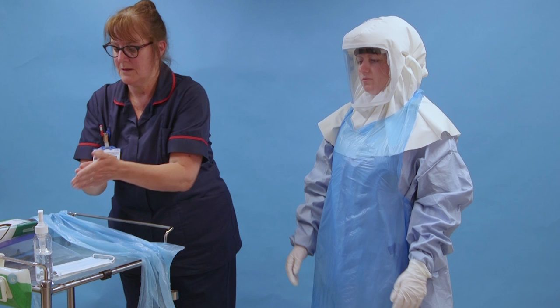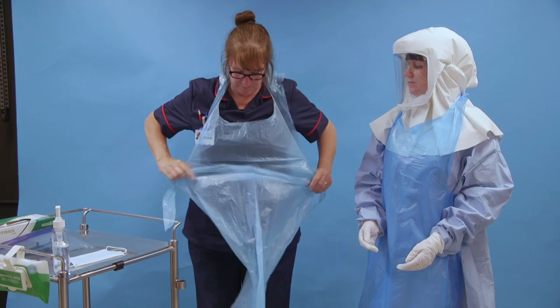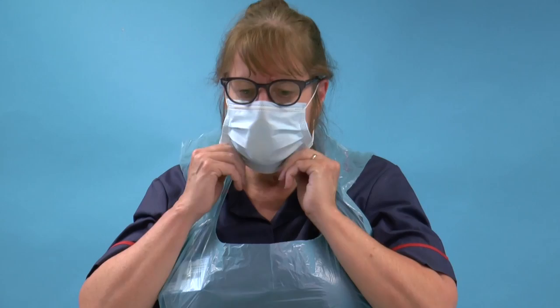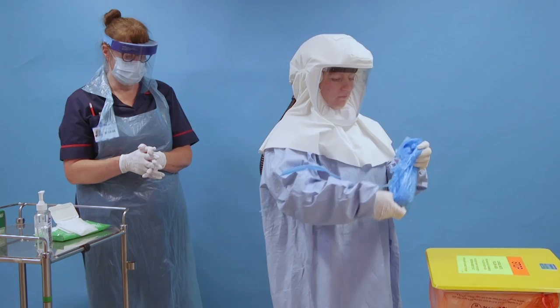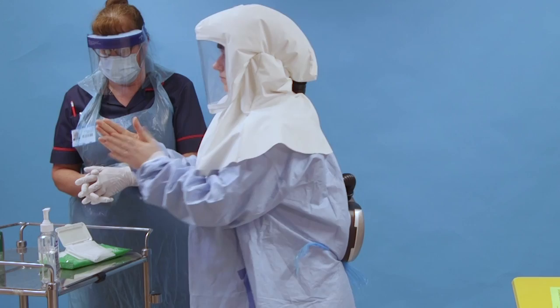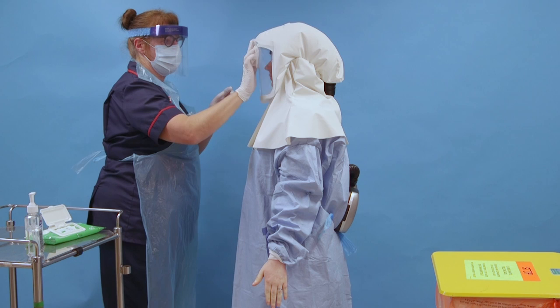Doffing your Perso respirator and other PPE is a two-person procedure and must be done with a buddy. The buddy cleans their hands using alcohol hand rub and puts on PPE: an apron, a surgical mask, eye protection if required, and gloves. Remove your gloves and apron if worn and dispose of them as clinical waste. Clean your hands using alcohol hand rub. The buddy then decontaminates the Perso hood using Clunel universal sanitising wipes in the green pack, starting with the front section, which is the most contaminated area.